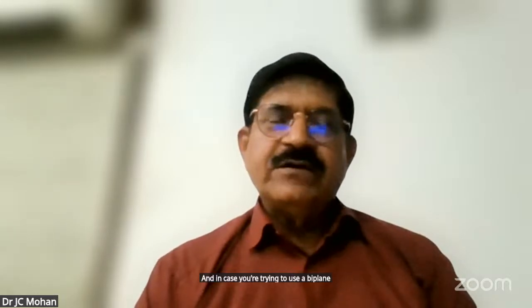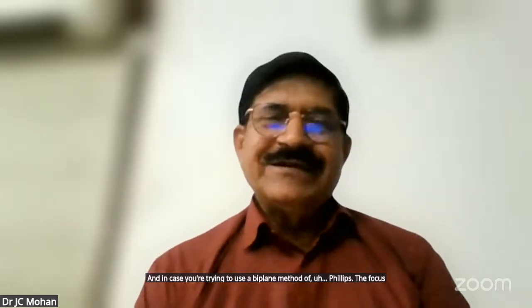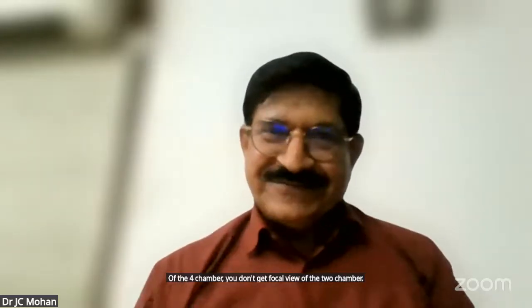And in case you are using the biplane method of Philips, the focus view, when you get off the four chamber, you don't get a focus view of the two chamber. That is the major difficulty.